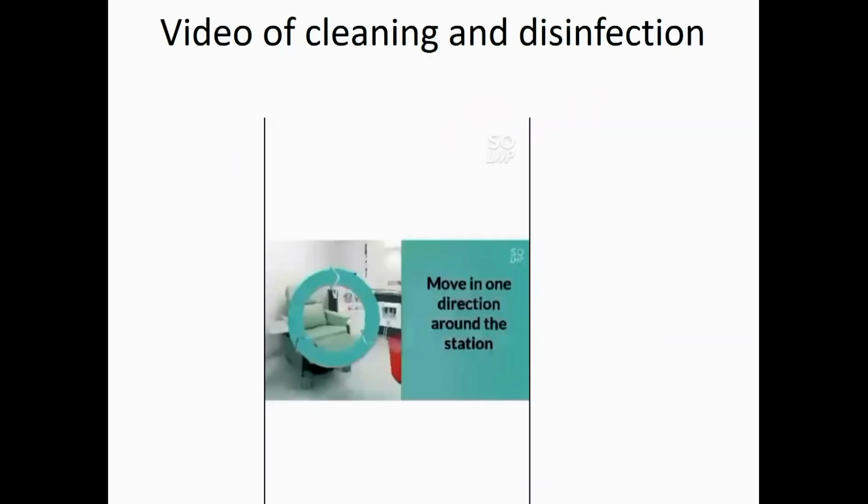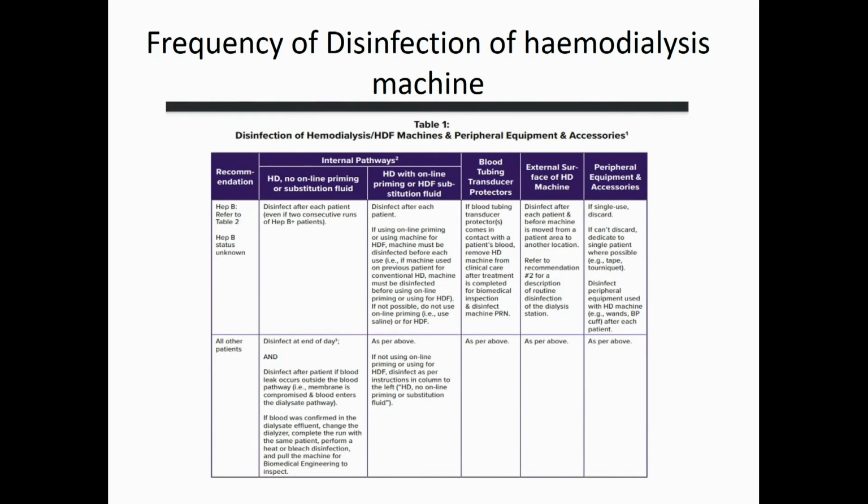I'm talking about chemical disinfection at the end of the day. But if you do it every day, he says the endotoxin filter... I don't know what your experience is. So we are doing hot every day. No, I'm not talking about hot. I am talking about chemical disinfection at the end of the day. Yeah, I think hot citrosteril is disinfection. That's what we are talking of, right? Yeah. I think what Dhananjay is talking about is the front cleaning. Yes. Yeah, hypochlorite. Yeah.